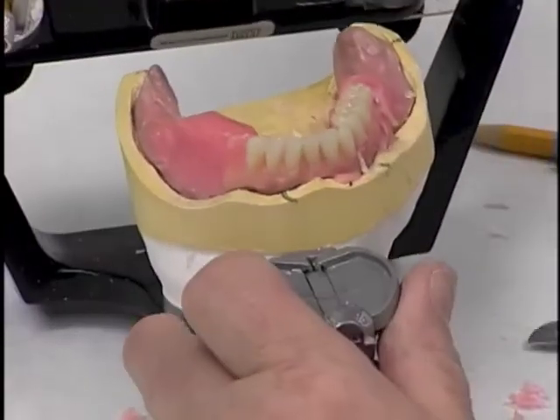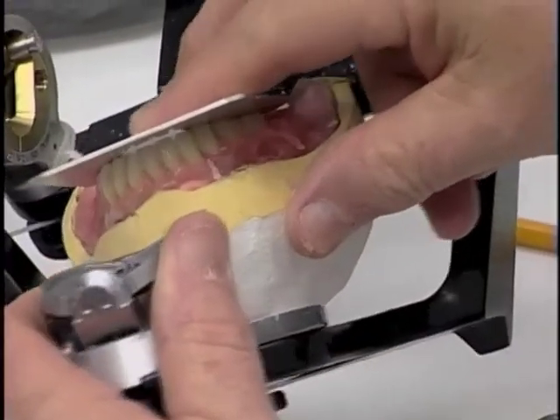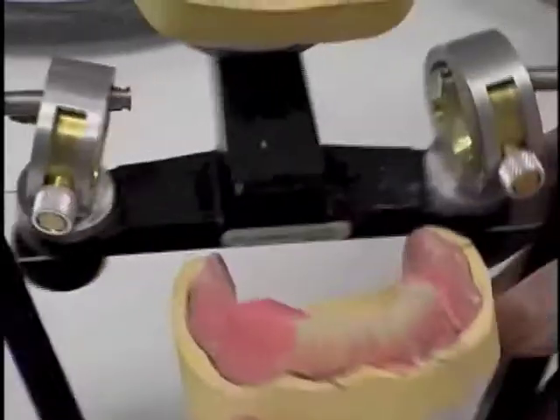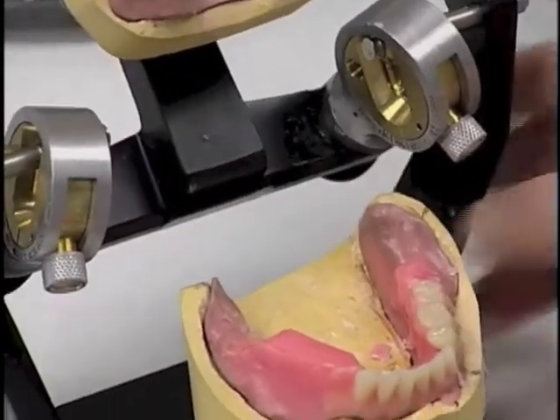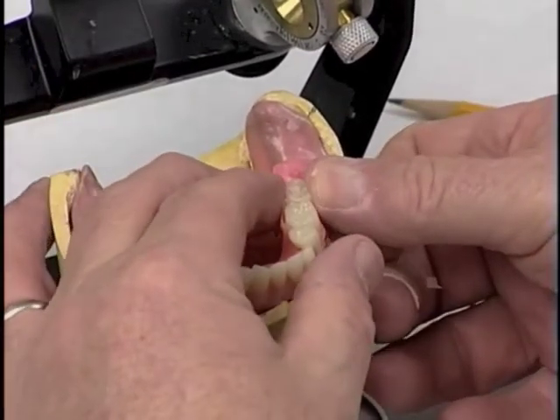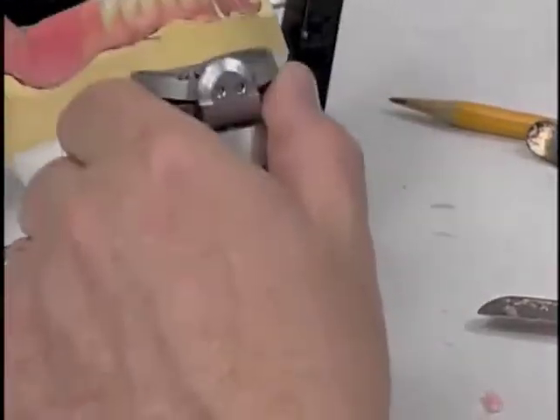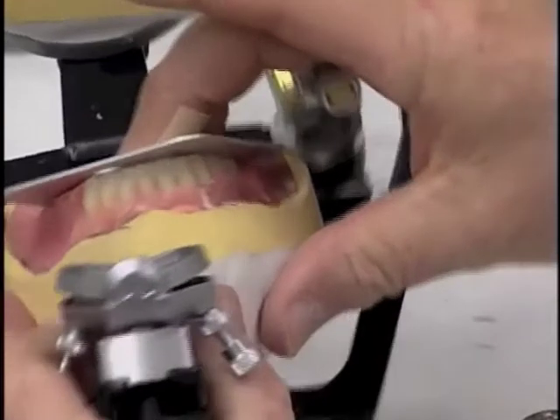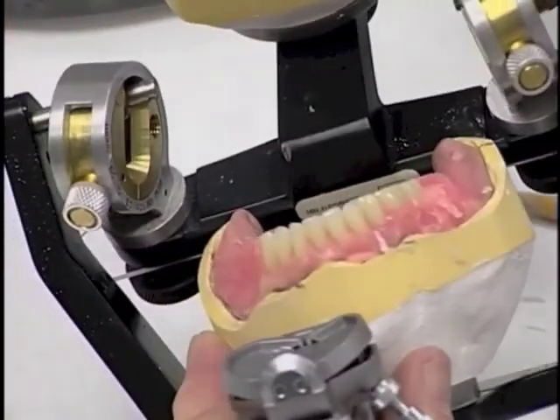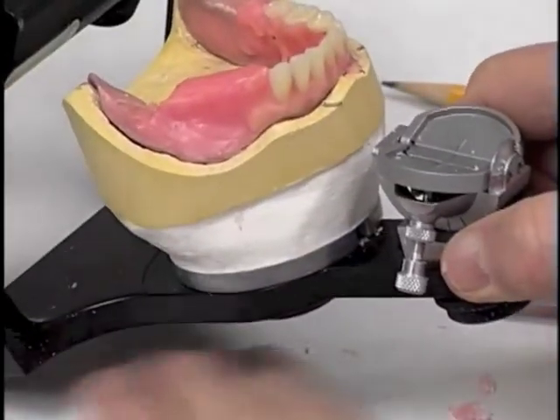And again, with the occlusal plane guide, we're going to check and mash that tooth into position so that all cusps touch the occlusal plane guide. That seems to be in pretty good condition, except this tooth is a little bit out to the buccal, so I'm just going to mash that tooth lingually just a little bit, and again check the occlusal plane to make sure that all cusps are touching it. We seem to be in pretty good condition with that. Now we can go to the other side.